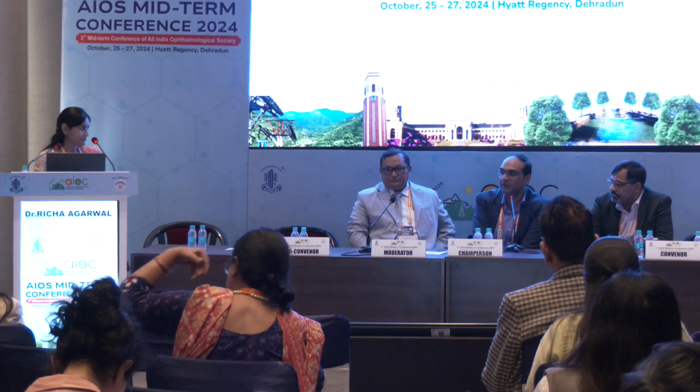Thank you. Actually, for sulcus implantation, there is something known as the rule of 9, what you said, it's fine. But if you are going to capture the IOL in the rhexis, then you don't need the IOL power adjustment, because the ELP remains the same. So you should keep in mind, if you are going to capture the IOL, don't change the IOL power. Yes, sir. That is one important point.